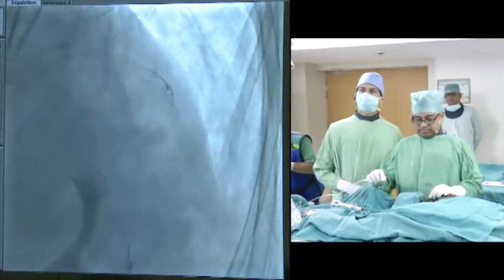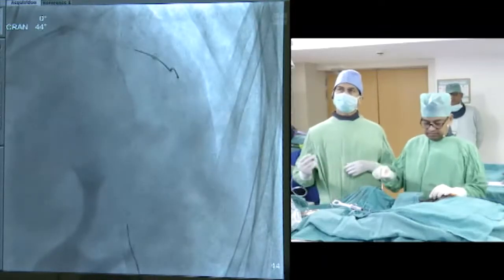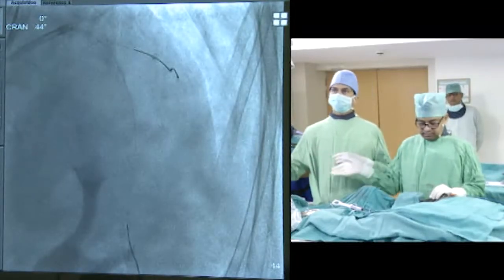Any thoughts from the panel? You've done this differently at home, Dr. Kroll.